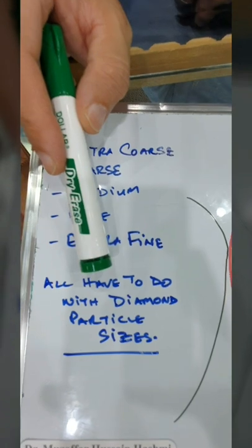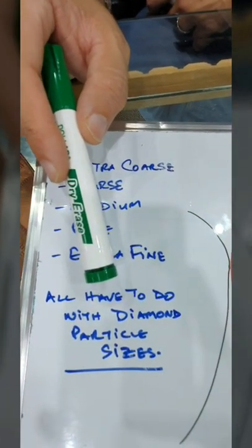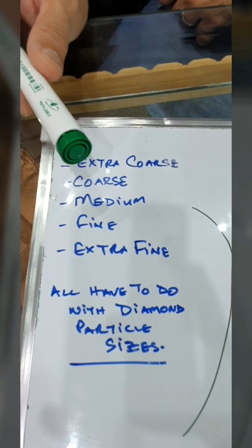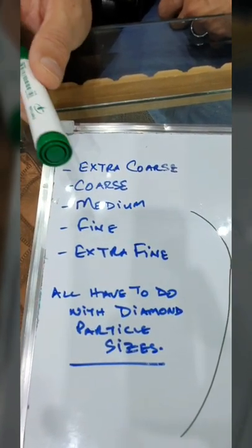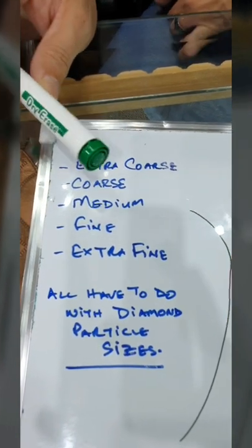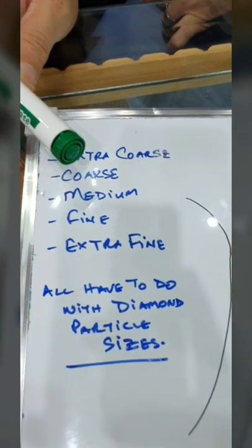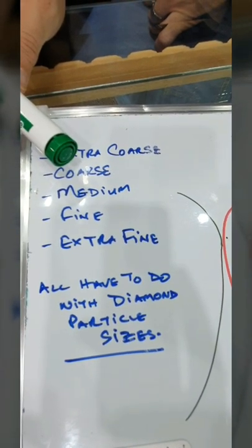Extra fine could be there if you're doing a very fine, smooth prep to show in an examination. But to me, practically coarse or extra coarse would be best because they would leave the surface rather rough. And when it comes to cementation, in my opinion, they would allow for that roughness for the cement to engage into. Now, having said that, if you have the roughness and you have covered it with a temporary crown on the preparation, then invariably some cement from the temporary cementation process will stick to the tooth.